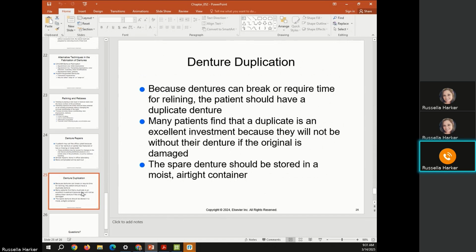An edentulous tray is not as deep, but if the tray requires modification to accommodate space and depth in the mucobuccal fold, rope wax will be added to the borders of the tray. Tray modification allows border molding, known as muscle trimming, to achieve closer adaptation of the edges of the impression to the tissues of the mucobuccal fold. So we just push the impression material closer to the tissue because we need to get a really good picture of what the tissue looks like, since we're not getting an impression of any of the teeth. The second appointment is a final impression.